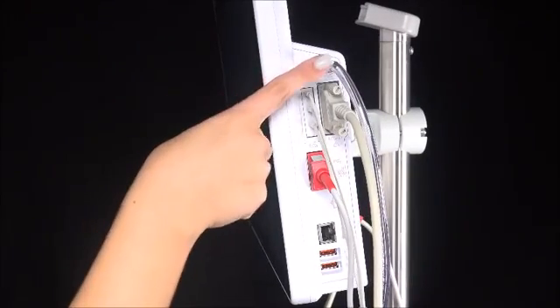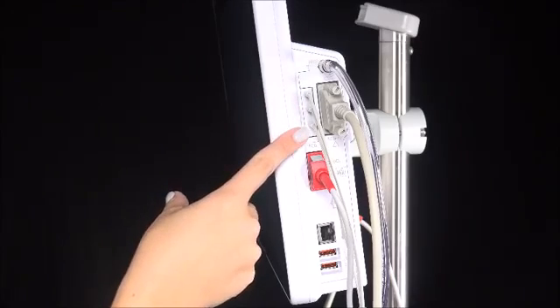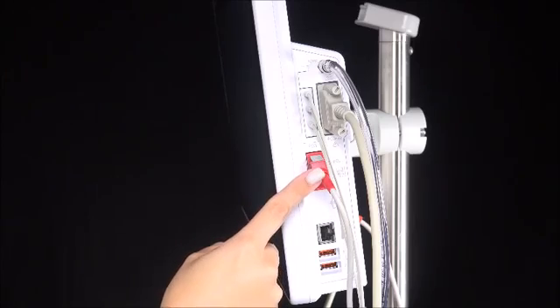On the lateral side, we can observe the connections for the parameters. We have the NIBP port, the connection for the standard ECG for 3 to 5 leads, the connection for the 10-wire ECG, SpO2, temperature, and 2 USBs that can be used for memory, mouse, or keyboard.